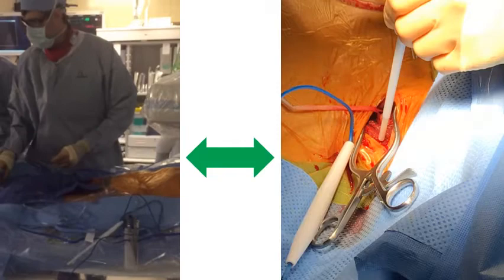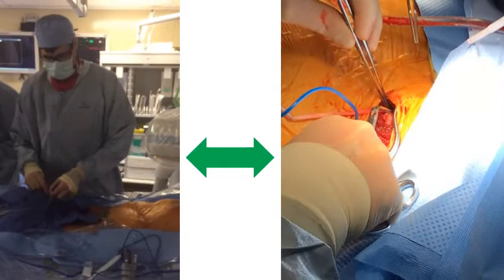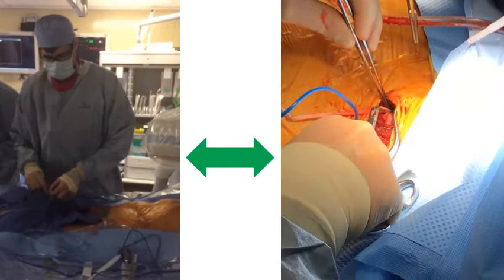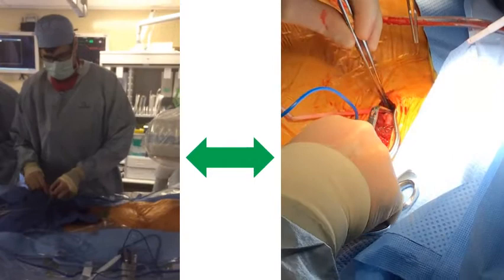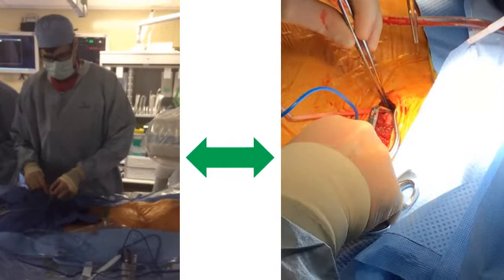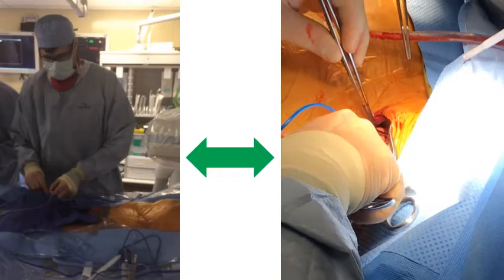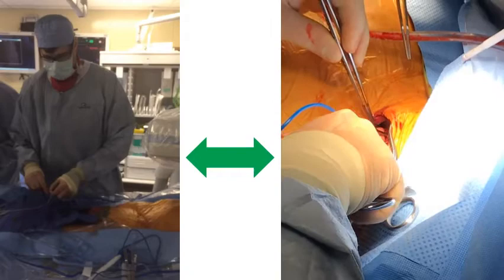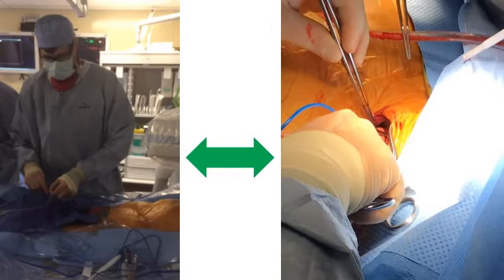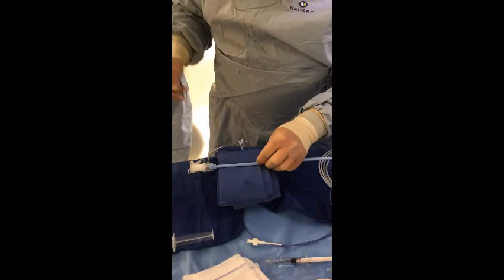Cardiology establishes the necessary femoral access simultaneous to the surgeon exposing the common carotid artery at the level of the omohyoid muscle. A test clamp was applied after heparinization to determine the need for shunting.